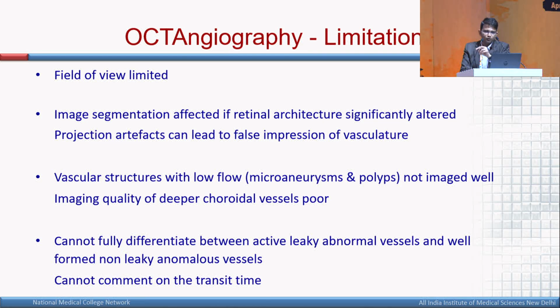Now coming to the last slide, conclusion. There are certain limitations of angiography, that is, the field of view is often limited. There are artifacts; commonly, projection artifacts can lead to a false impression of the vasculature. And vascular structures which have very low flow, such as microaneurysms and polyps, are not imaged very well because they need a very long interscan time, and that is not possible.